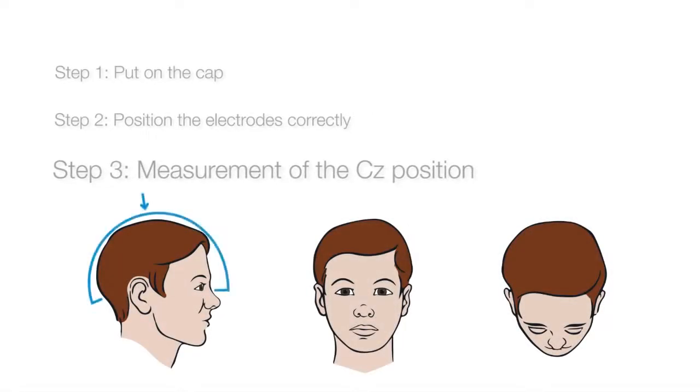Take the point halfway between the nasion and inion and the point halfway between the two preauricular points. The vertex electrode CZ is positioned where these two points meet.